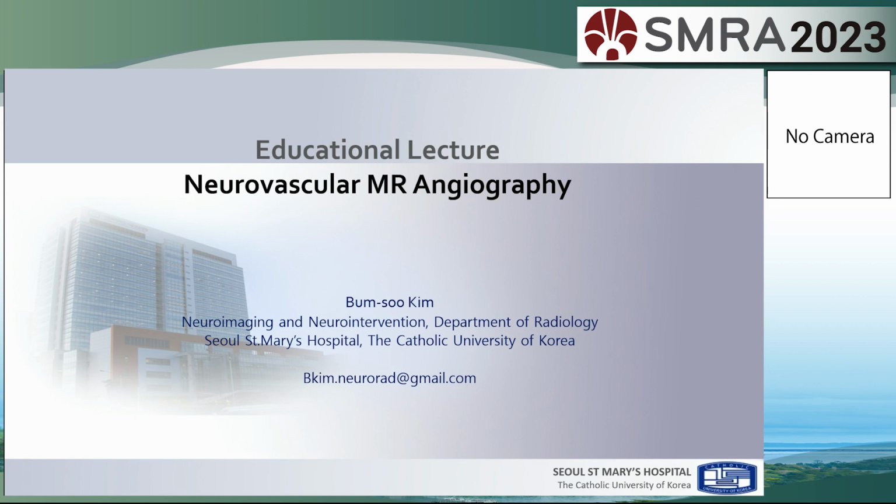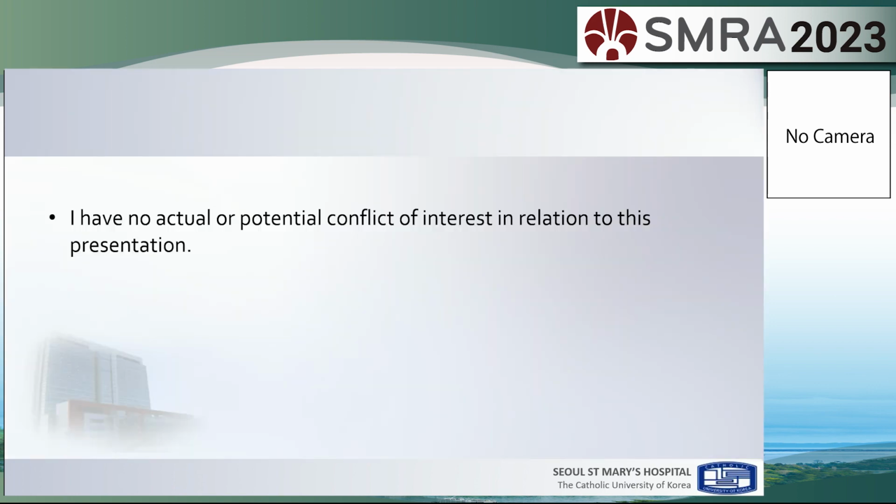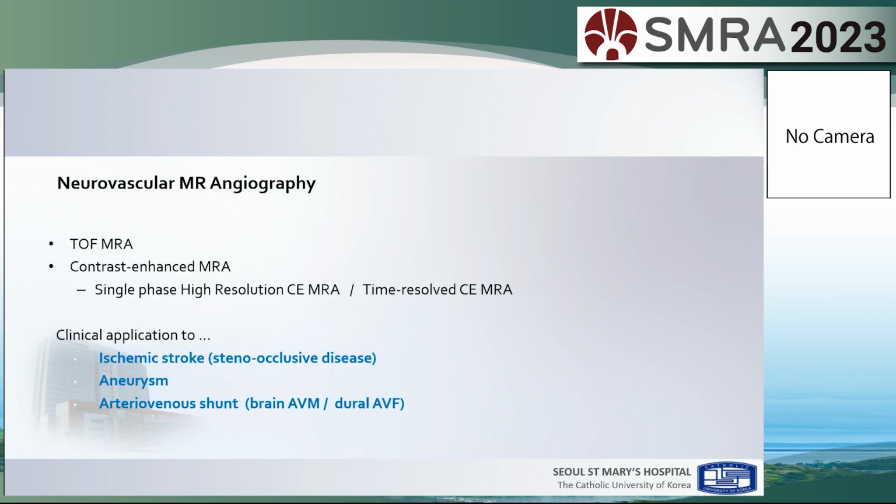Thank you, Chairman. I'm Bum-Soo Kim from Seoul, Korea, and thank you for giving me a chance to give an educational talk regarding neurovascular MRA and angiography. I packed my talk with the basic sequences, including TOF MRA and angiography and the contrast enhanced MRA and angiography, in the evaluation of ischemic stroke and aneurysm and briefly arteriovenous shunt.